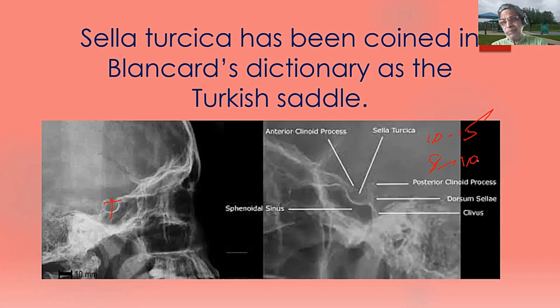The reason why I'm telling you this: the anterior posterior length is 10 to 15 millimeters. They will ask you, when do you call the sella enlarged? Your answer, sir: if it is 17 millimeter I measured, definitely enlarged. This is a common question. Again, I'm repeating a few points. The pituitary has to enlarge a minimum of 10 millimeters. Exam over. The anterior posterior length of sella should be 17 millimeter to call it enlarged.